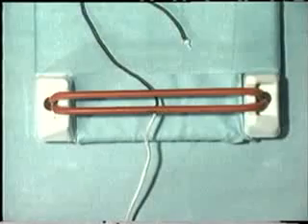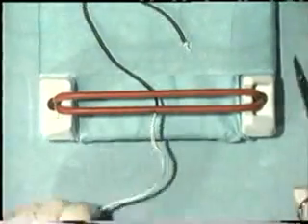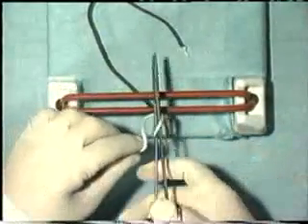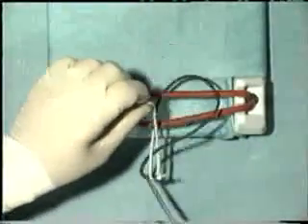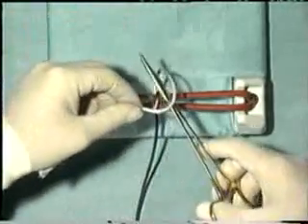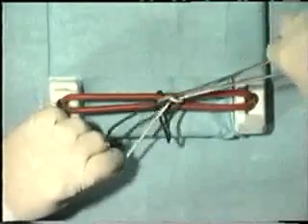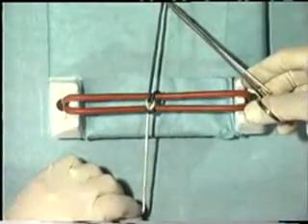The same principles apply when tying a reef knot with instruments. Take the instrument and with one throw over it, grasp the shorter end of the suture and gently pull it through and snug the throw down. Then do an opposite turn, again grasping the end of the short suture, pull it through, and you see the classic picture of a reef knot emerging.